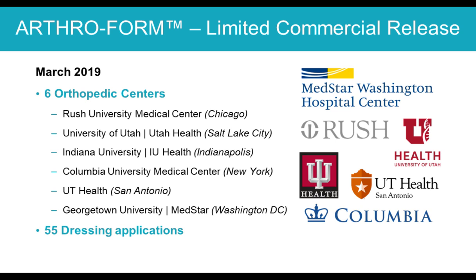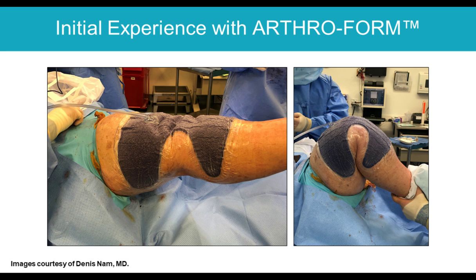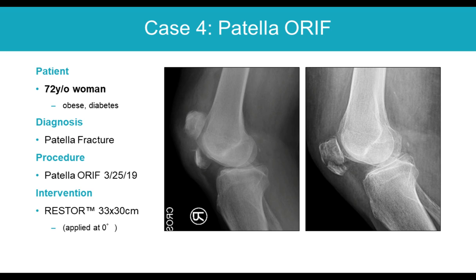I was part of a team that evaluated this in the spring of 2019. At 6 orthopedic centers, we evaluated this in 55 patients. And here are some images from patients who had knee replacement surgery or revision knee surgery across the country with these devices in place and fitting them well. I'll talk a little bit about my experience with this.